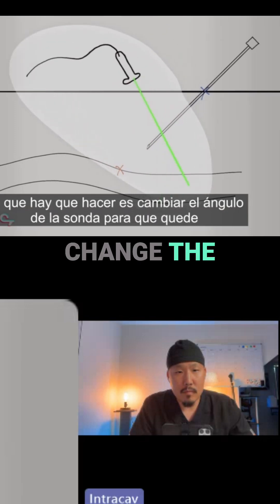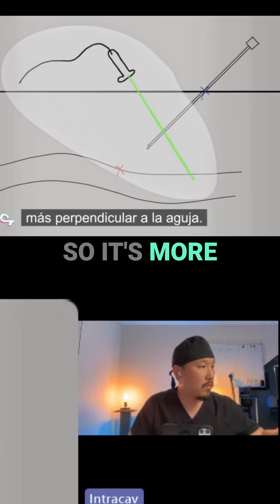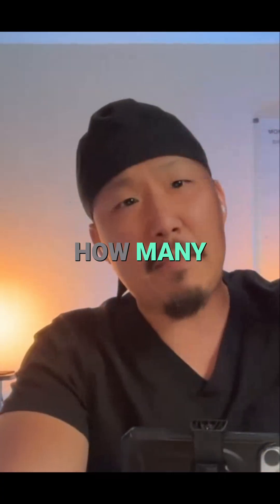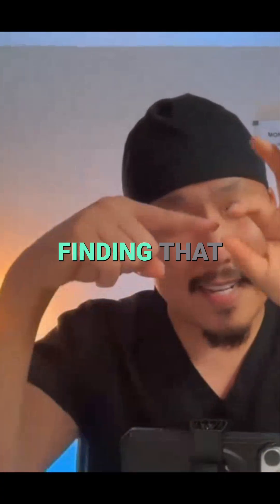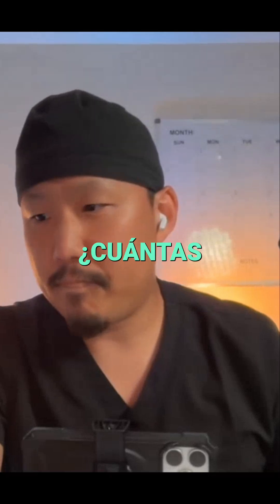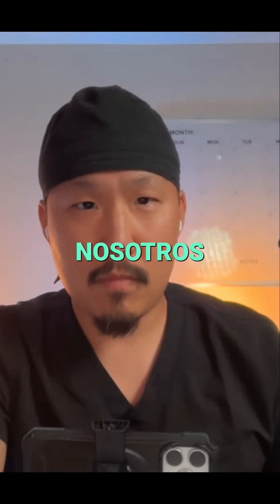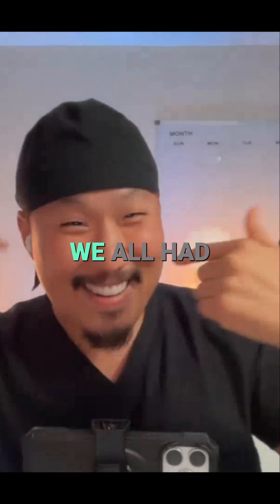How many people have issues finding that needle tip? How many people have problems finding the needle tip? I believe all of us. In my residency, we all have problems. The solution is to change the angle of the probe so it's more perpendicular to the needle.